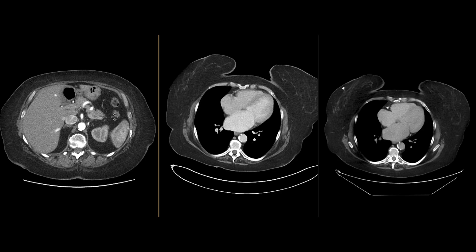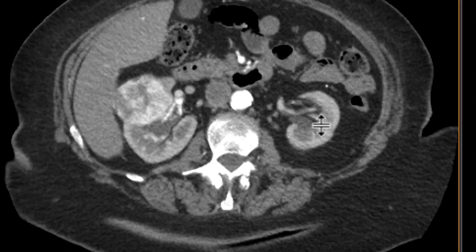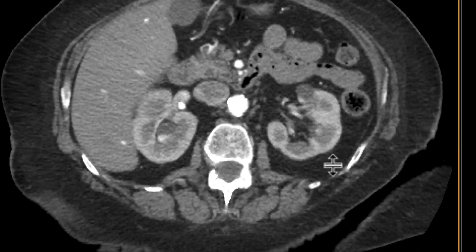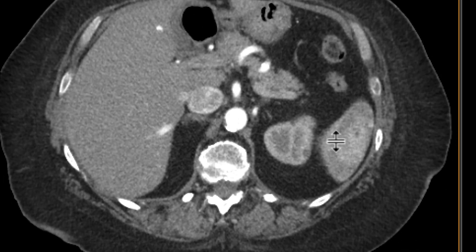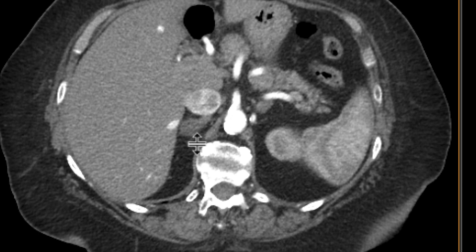This is an interesting patient with an adrenal mass. Starting with the kidney, we see a large mass with heterogeneous enhancement — this is a renal cell carcinoma, clear cell variety. When you look at the right adrenal gland, there is also a low-density mass. On the non-contrast phase, it showed less than 10 Hounsfield units, so it's compatible with an adenoma — something we don't really need to worry about.